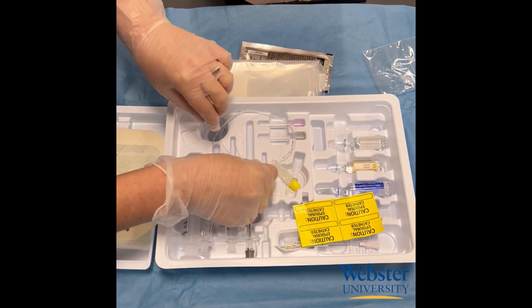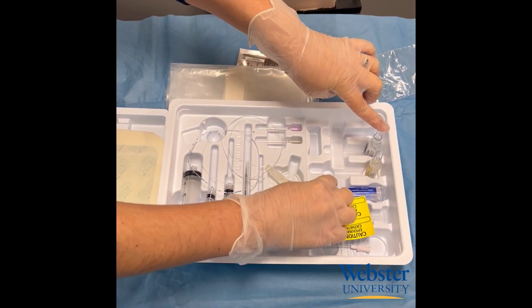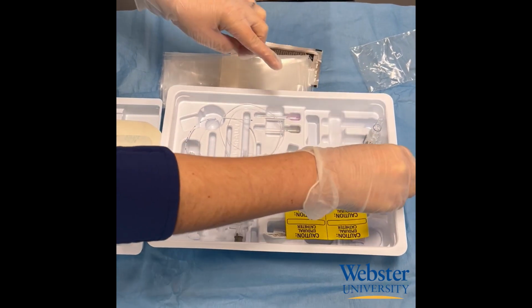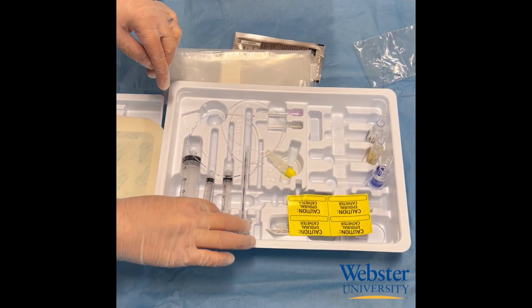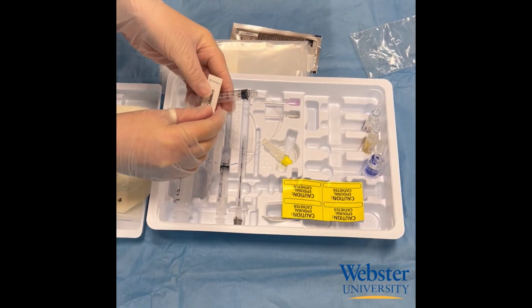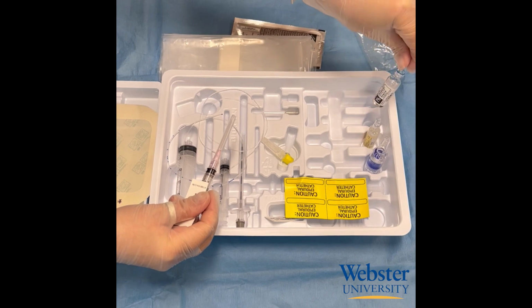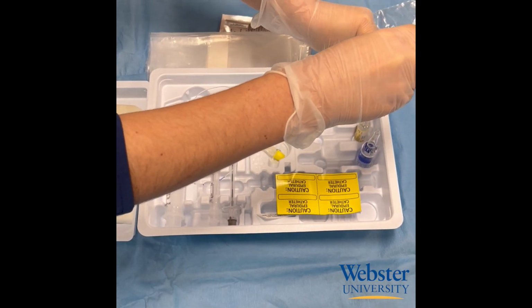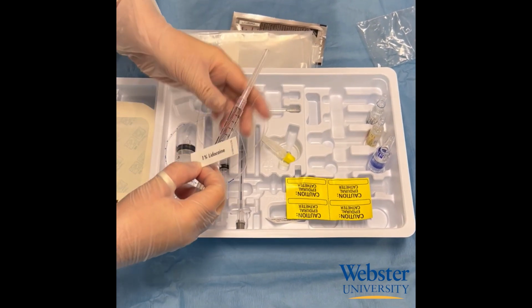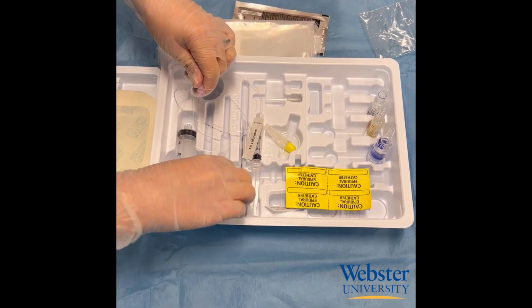Open up the ampules that contain the medications. Here, I have the 1% lidocaine to numb the skin and a label for it. Next, I have the 1.5% lidocaine with 5 mcg per mL of epinephrine for my test dose.